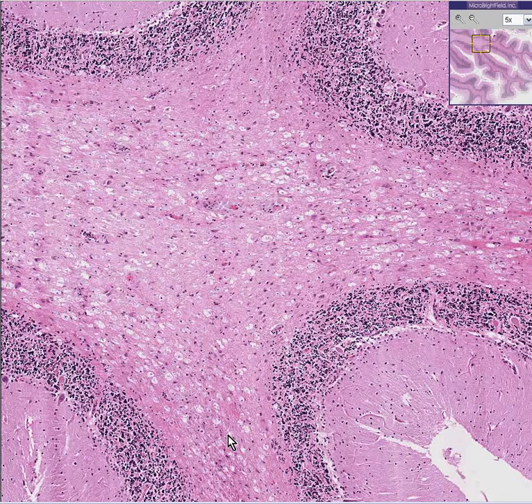In this area, you have a fairly less severe amount of abnormal myelinization. Throughout here, there's a lot of irregular things. You see vacuoles bigger than they should be. That's just defective abnormal myelinization, which all the leukodystrophies are, and this particular one is one of the more common ones. Actually, they're all rare, but one of the more common ones you might hear of specifically is adrenoleukodystrophy.